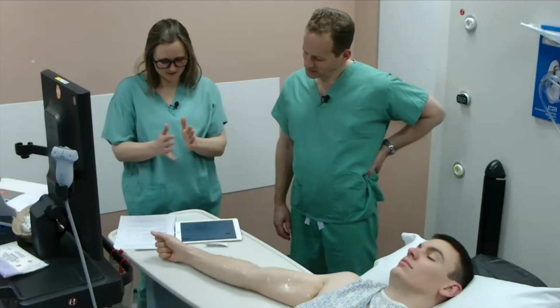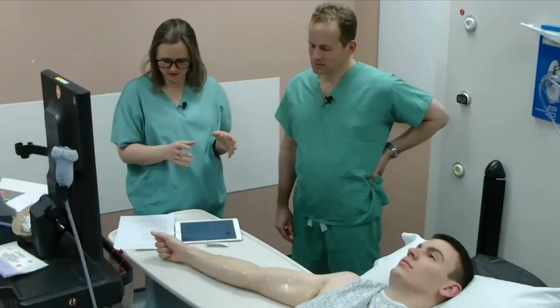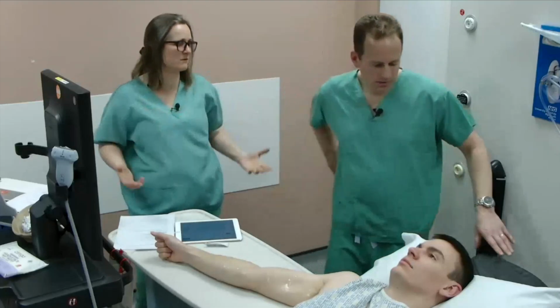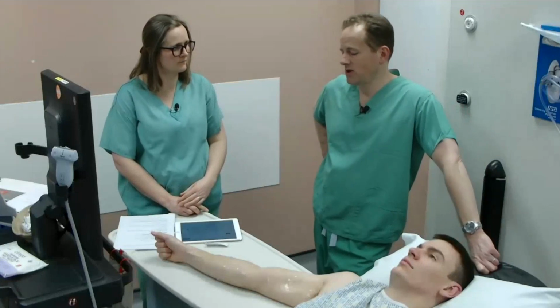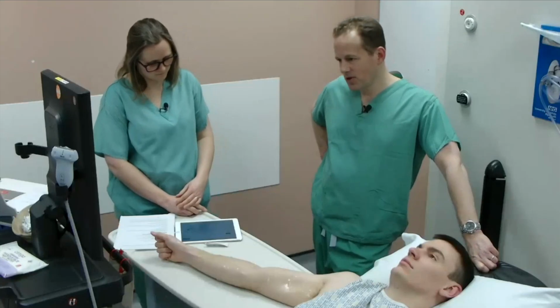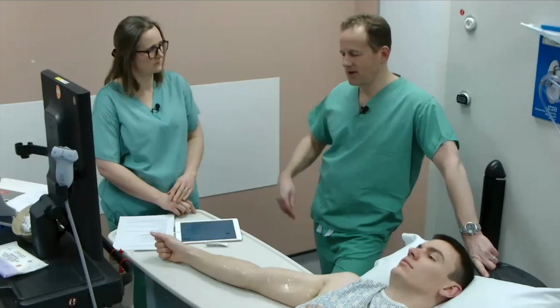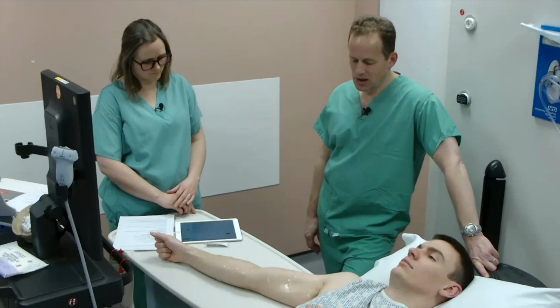And then one last question from me was, for anaesthetists who are newer to awake hand surgery, what advice would you give? Give yourself time. That's the most important thing, because you're going to be slower when you're first starting out. So get everything ready in advance, get all your drugs drawn up, get your probe covers on, you don't want to be doing all of that out of your block time. Send nice and early. If you can overlap cases when there's a local on the table or whatever, do that.